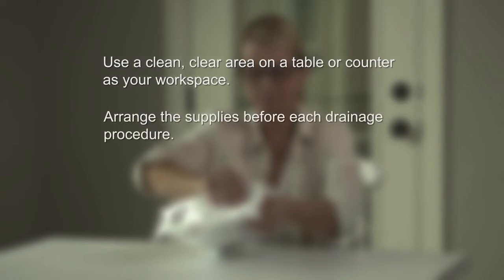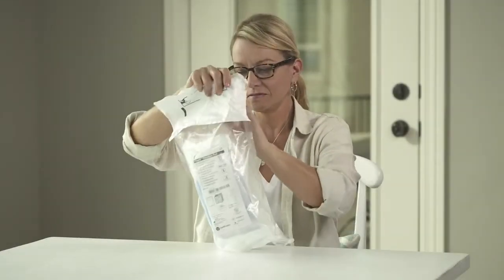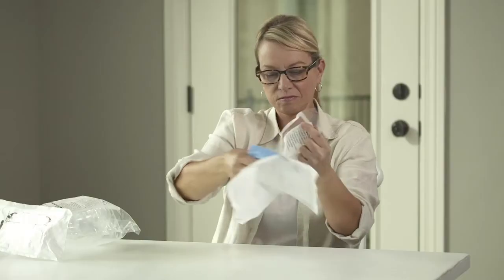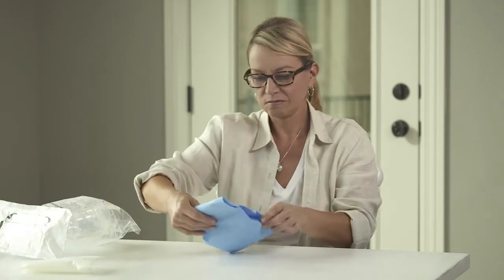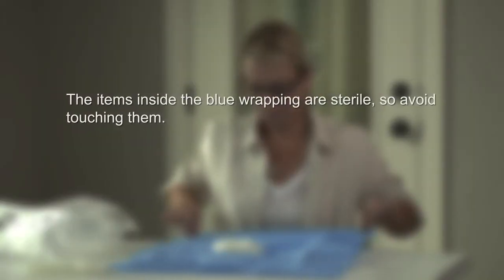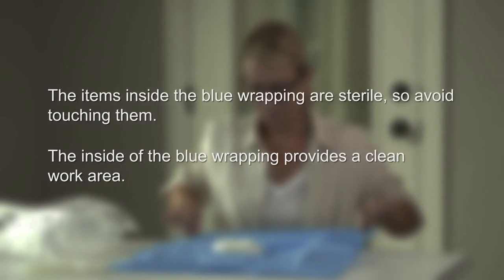Make sure you have a clean, clear area on a table or counter to serve as your workspace. You will want to arrange all of the supplies prior to beginning each drainage procedure. First, open the drainage kit bag and remove the procedure pack. Next, open the procedure pack and remove the blue wrapped bundle and adhesive dressing. Set the adhesive dressing aside and place the blue bundle on your workspace with the folded side up. Carefully unfold the blue wrapping by pulling on the outer edges of the bundle. The items inside are sterile, so avoid touching them. The inside of the blue wrapping provides a clean work area.